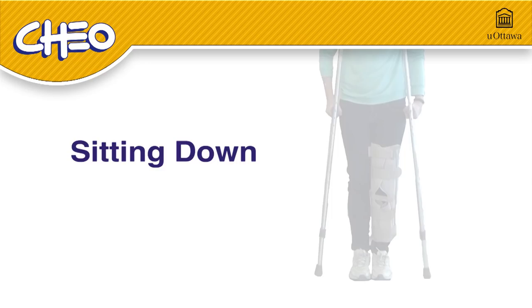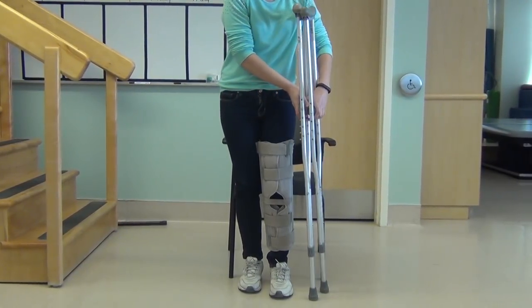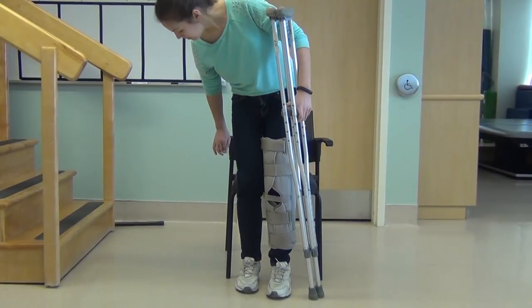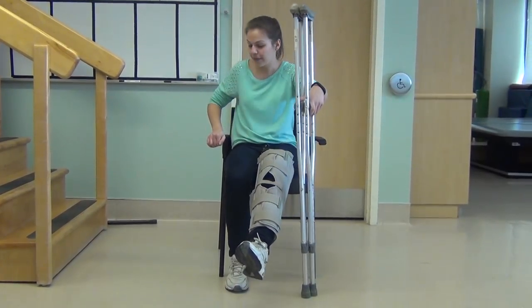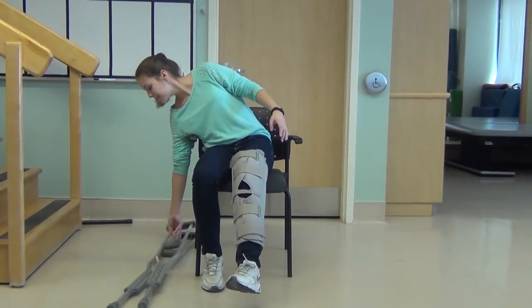Sitting Down. Turn around so the back of your good leg touches the chair. Place both crutches in one hand and hold them by the handles. Place your free hand on the armrest, hold your injured leg out, then slowly lower yourself into the chair.